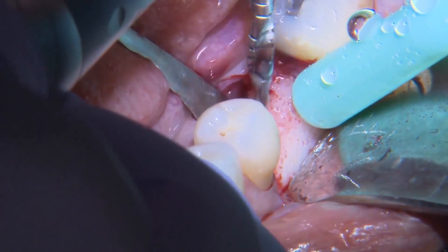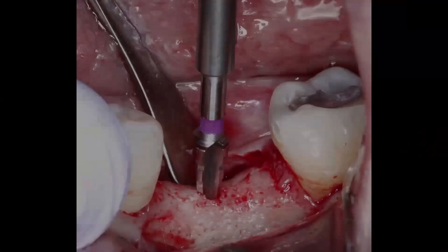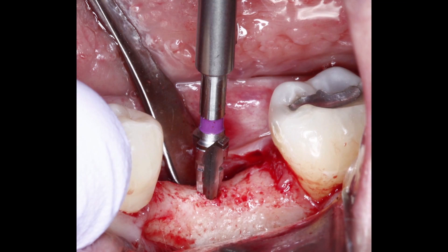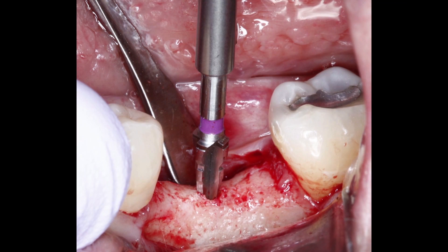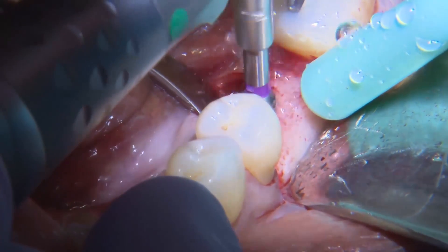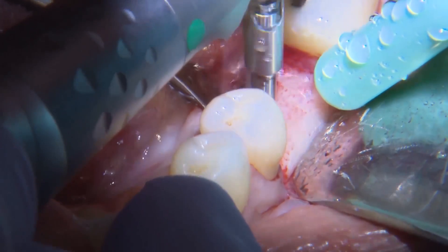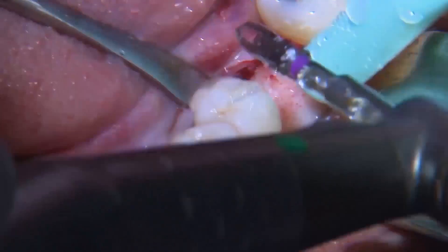After the first start drill, I'll go ahead and move to the second start drill before going into the shaping drills. The shaping drills for the Han implant system are designed so that the shape of the shaping drill matches the shape of the implant.